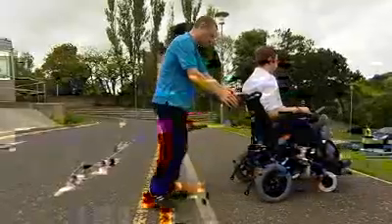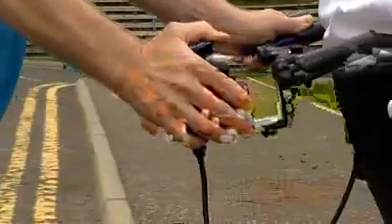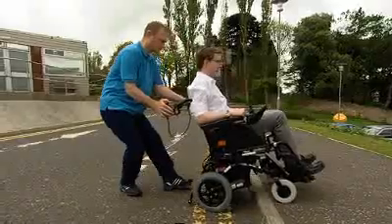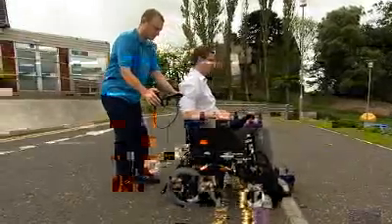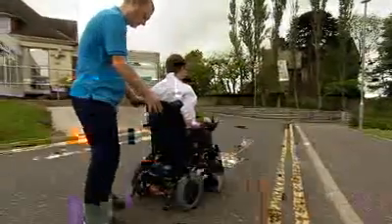When you are sure it is safe to cross, move the wheelchair backwards. Then grip the push handle and controller as the back wheels drop down off the curb. Continue in a straight line until both front wheels also come off the kerb.